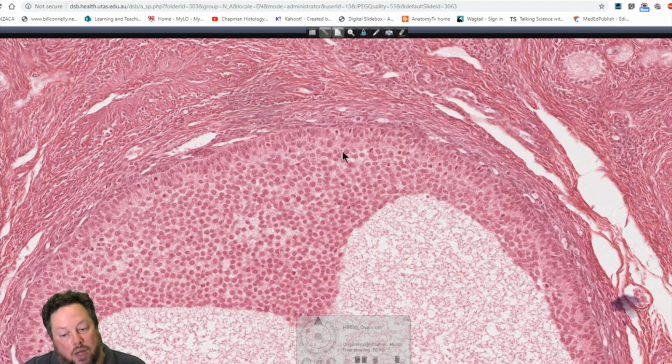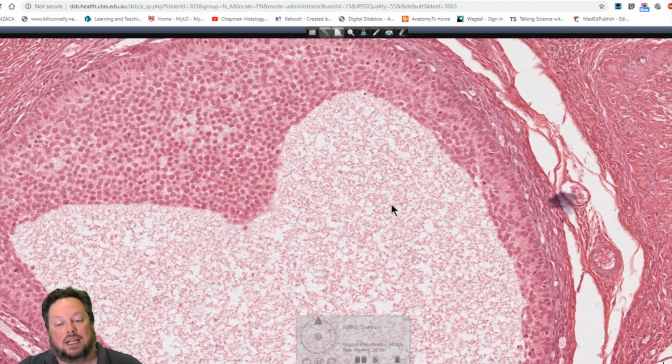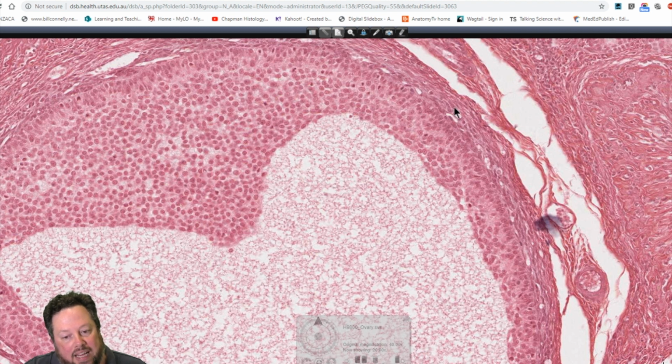So what happens is after ovulation, blood usually comes into this antral region. It forms a large body called a blood body or a corpus hemorrhagicum, and then the basement membrane breaks down, and the granulosa and the thecal cells begin to intermingle with each other, and as they do, they transform in structure. Particularly the zona granulosa transform from a more protein-producing appearance to a more steroid-producing appearance. So they get lots more smooth endoplasmic reticulum. They gather cholesterol from the bloodstream, and so they transform into cells known as the granulosa lutein cells.